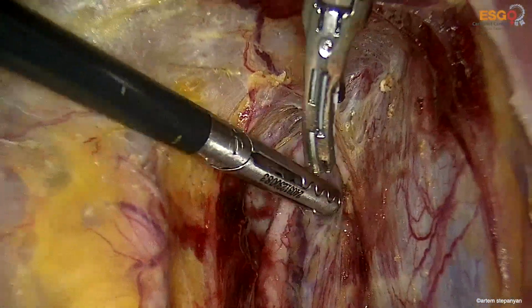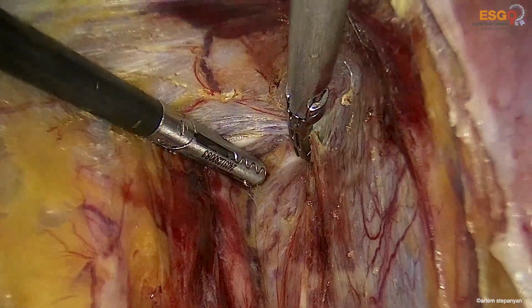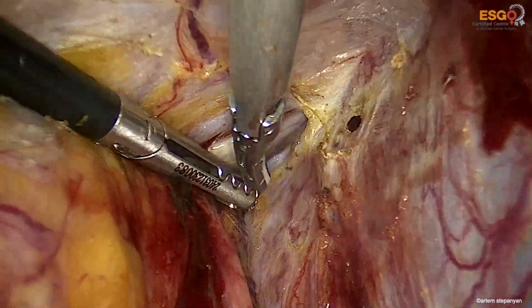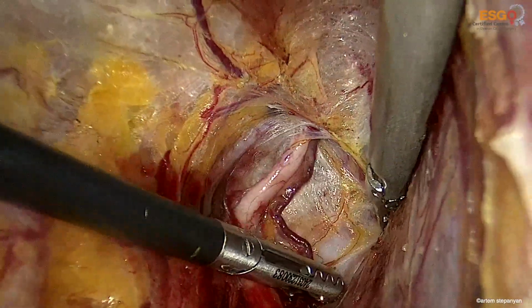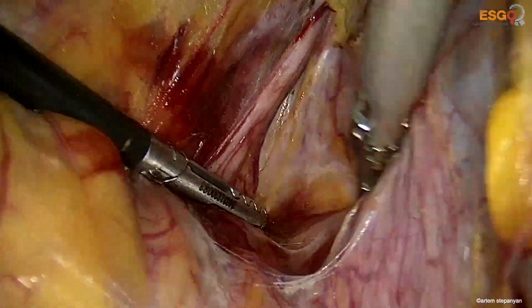Oncologically speaking, we enter the so-called Okabayashi space, which is formed by the mesoureter and the inferior hypogastric plexus laterally and the mesorectum medially.